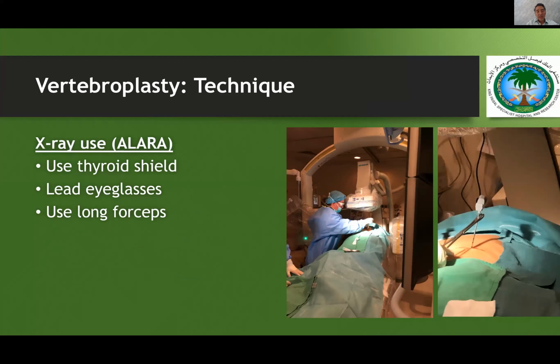Now, regarding the radiation, there is something in radiology called ALARA: as low as reasonably achievable. So if you're not actually doing a procedure, do not press the pedal in the field. Of course, protect yourself. I always encourage people to use forceps. Use long sponge forceps to guide your needle where you're going to angle and get the axis, and then hold with your hand and continue. But during the first angulation, there's a lot of radiation to your hand, so please avoid that.